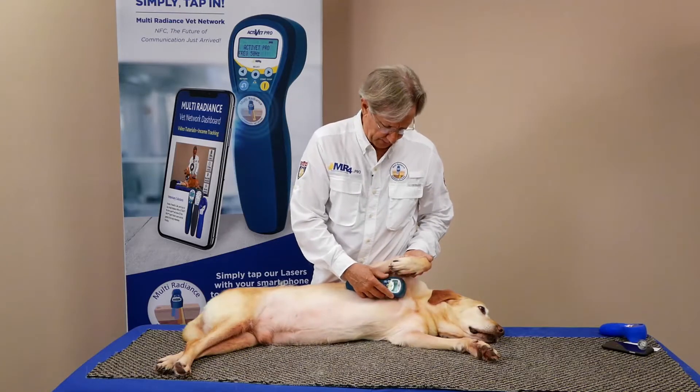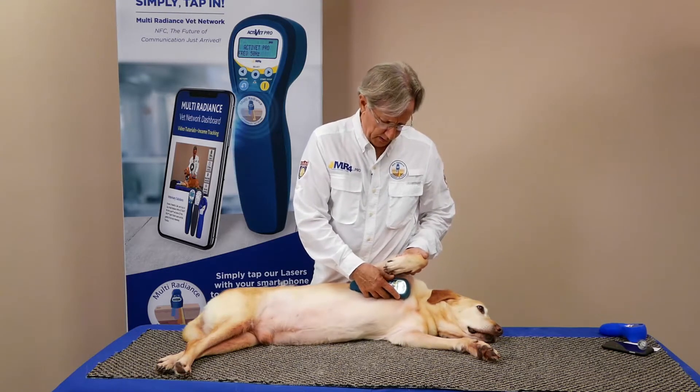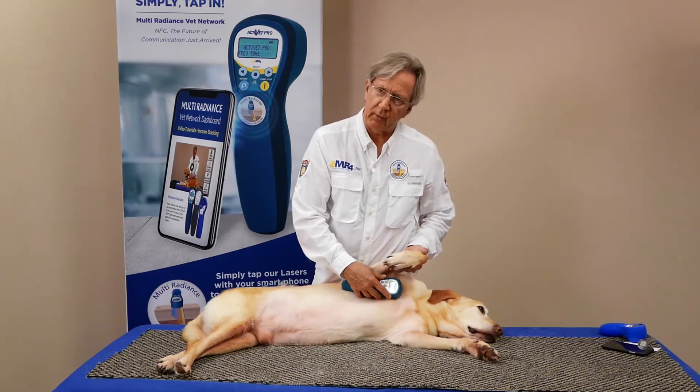You don't have to do it fast, just apply a fairly firm amount of pressure just to compress that lymph node and facilitate that drainage of fluid, and that's going to help reduce that swelling very quickly.